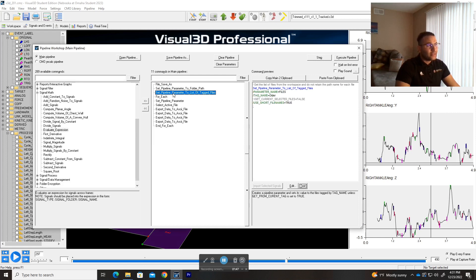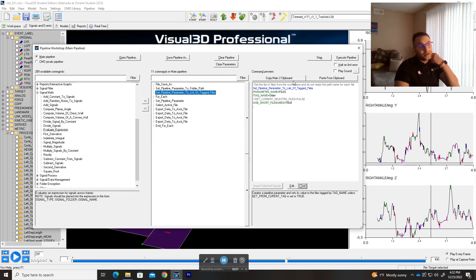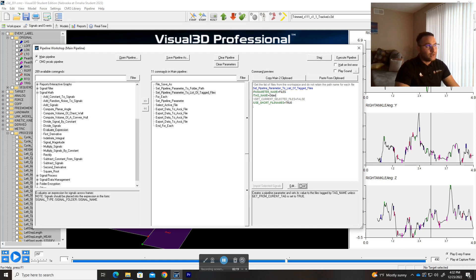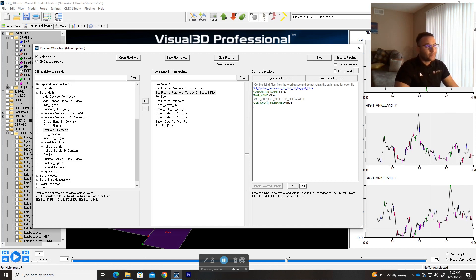Next is 'set pipeline parameter to list of tagged files'. If you're using specific files within a tag this is very helpful; otherwise just put all files. I put 'older' because we have that tag added. For example, if you have a tag with analyzed data and a tag with not analyzed data, you choose the analyzed tag. Also set short file names to true — otherwise it gives you the whole path, which we don't want.